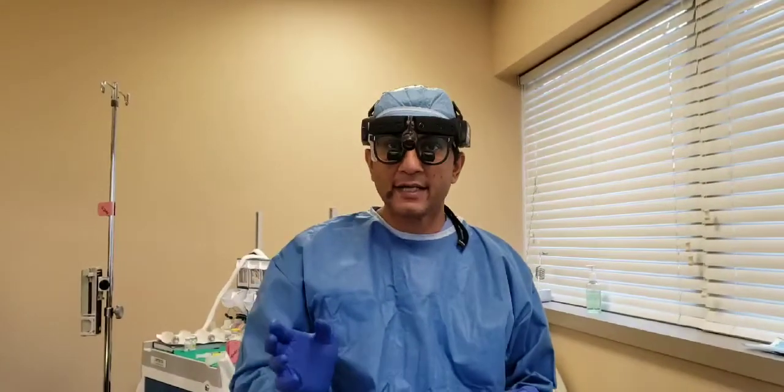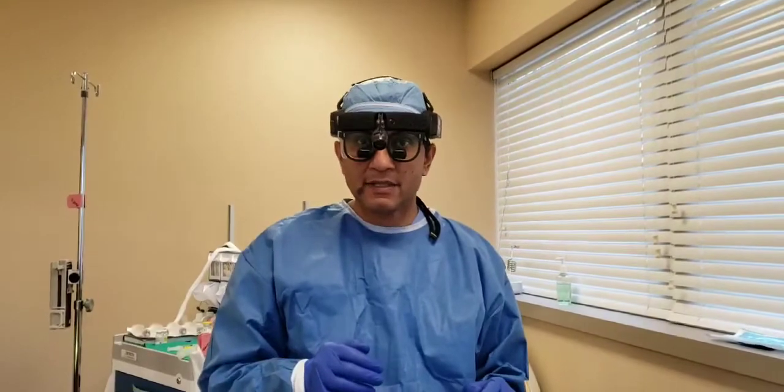Hi, this is Dr. Shahar Khan. I just finished an en bloc on the right and also on the left for a very nice pleasant lady.